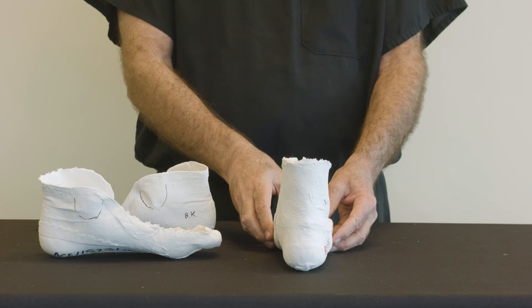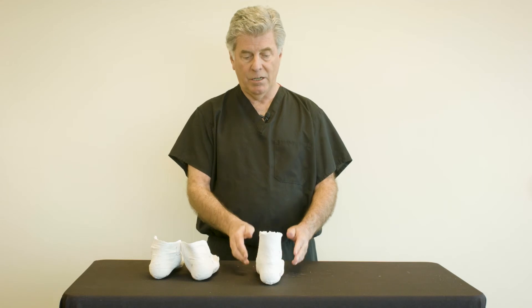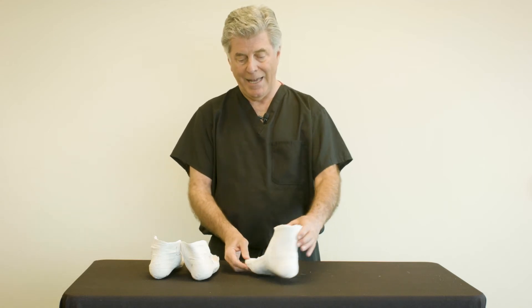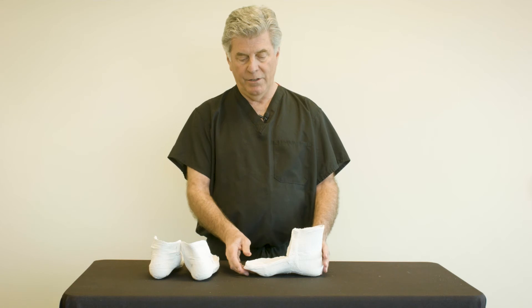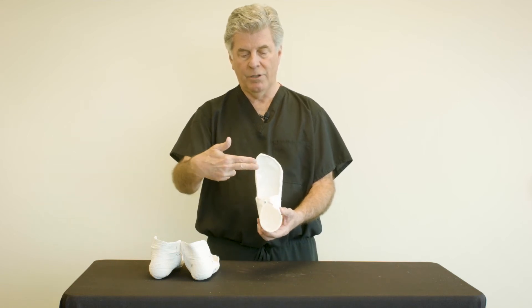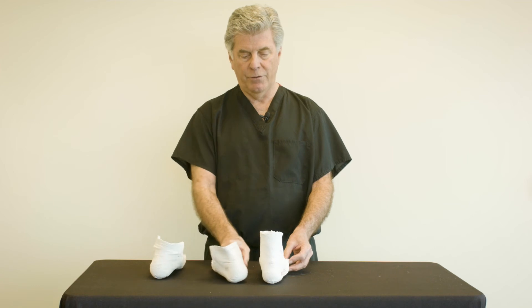Here is an example of a cast where the practitioner reduced supination deformity, resulting in an almost perfect alignment of the rear foot and a good capture of the true shape of the medial arch. This was accomplished by the practitioner putting the foot in subtalar neutral and simply pushing down gently on the first ray, correcting forefoot supination.